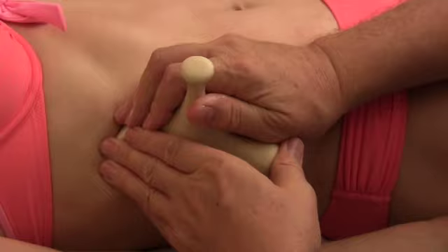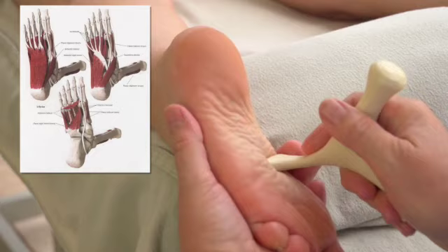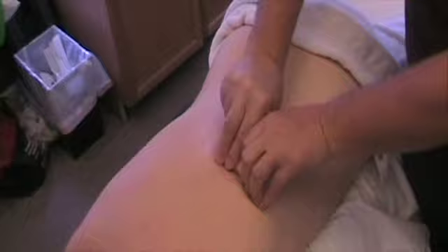If I was actually working on her rather than demonstrating, I would of course keep both of my hands on her. You can use this on the side of the foot as well — all over this calcaneus. When we go over here along this side, picture there's a muscle that runs right along there. She's very tender right in that spot.